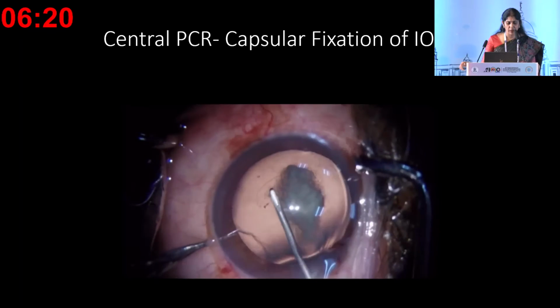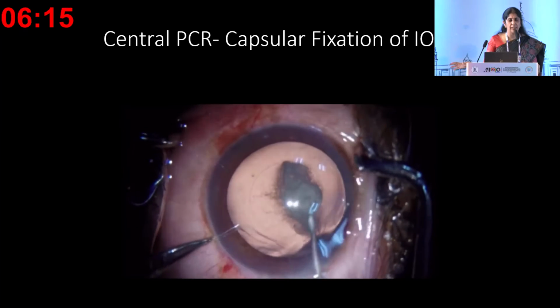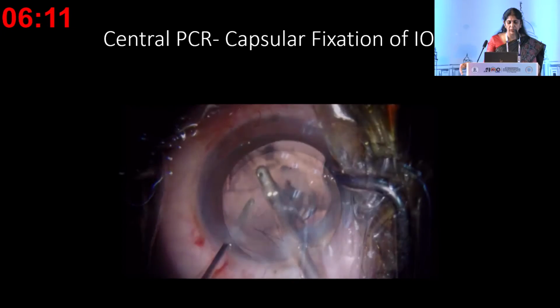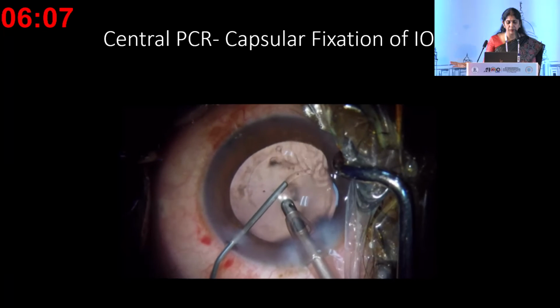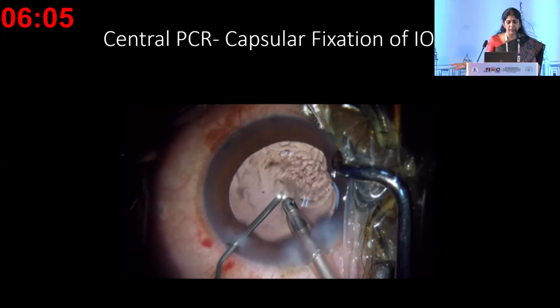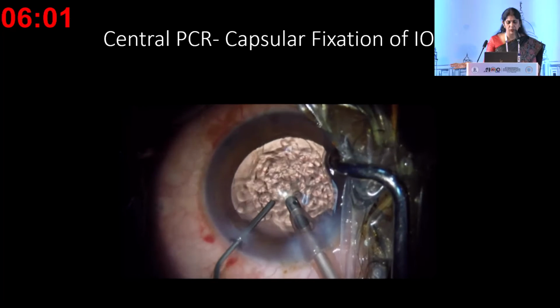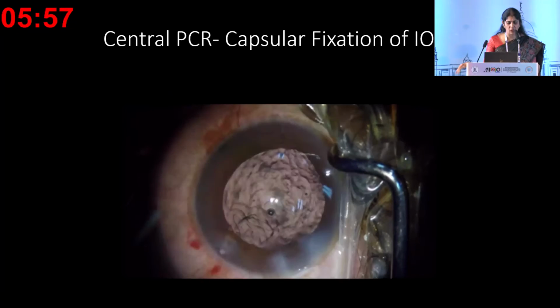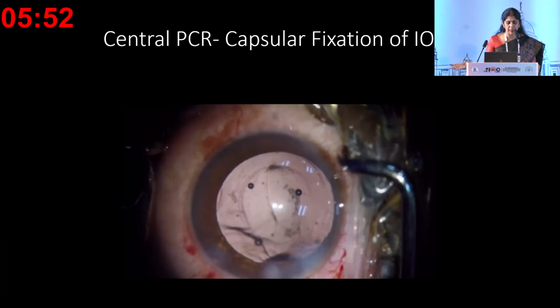This is a patient who had a posterior polar cataract with a pre-existing posterior capsule rupture. So there's a high chance here, and there was a PCR noticed earlier pre-op also through an OCT. A lot of care is being taken to not enlarge the PC rent. So before the IA probe is retracted, you want to inject a dispersive viscoelastic. I would do this whether there was vitreous loss or no vitreous loss.